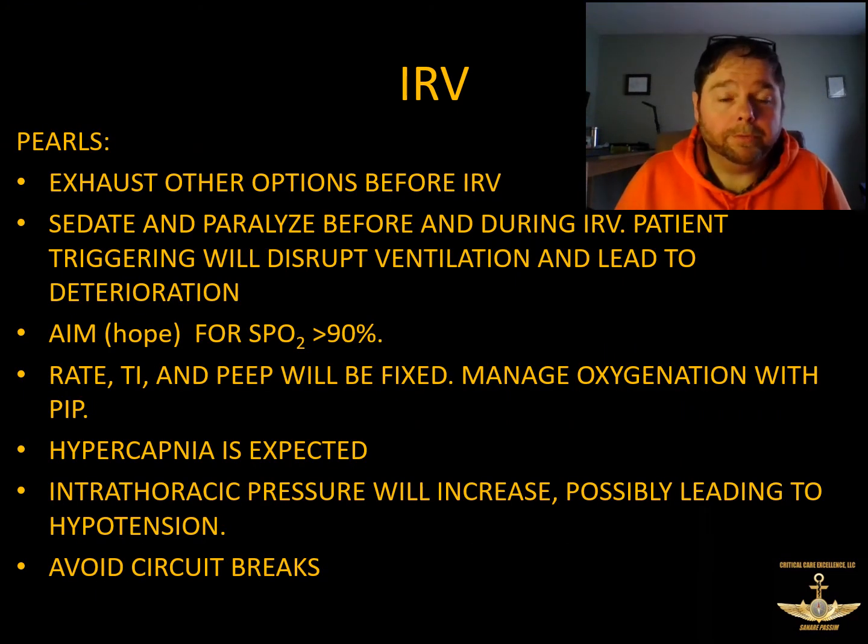So, our pearls. These are the things you want to think about every single time before you decide to do inverse ratio. The very first thing is to decide you've done everything else you can before doing inverse ratio. This mode is not free, it is not without side effects, it is not without complications, and it really should be just about the last thing on your list of how to oxygenate a really difficult sick patient.